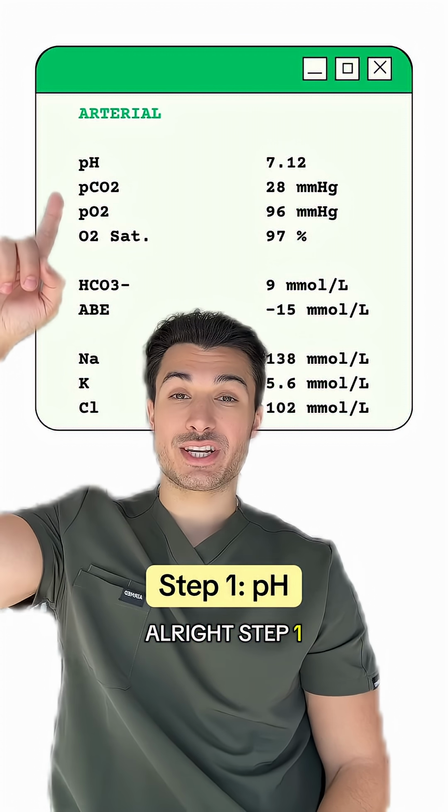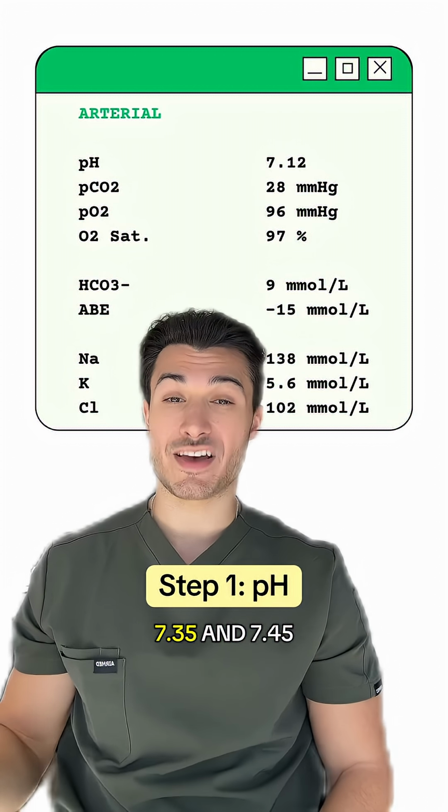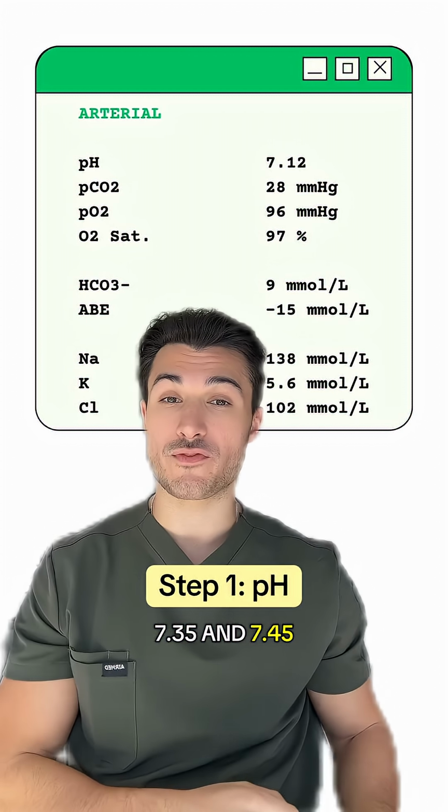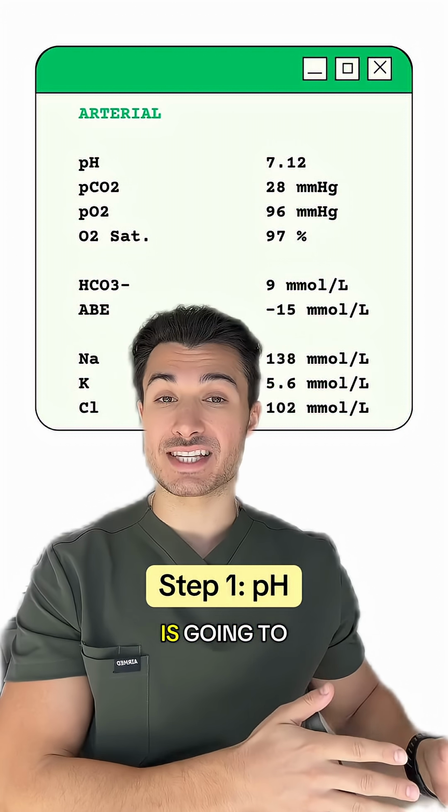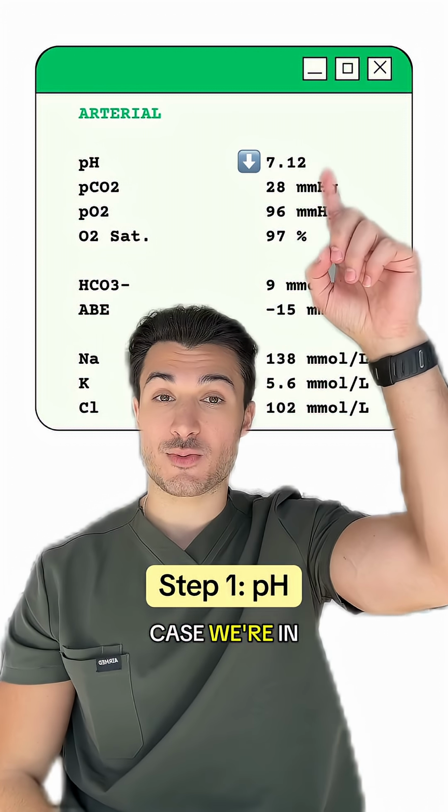All right, step one, check the pH, which is normally between 7.35 and 7.45. So anything below that is going to be acidemia. Anything above that is going to be alkalemia. So in this case, we're in acidemia.